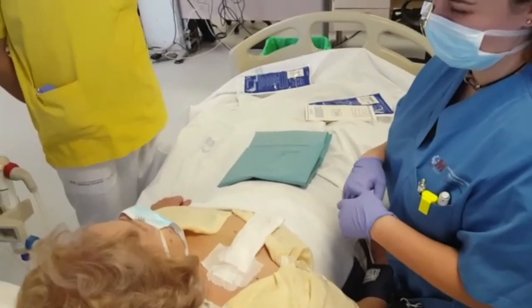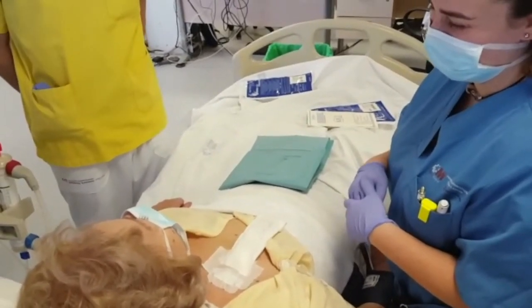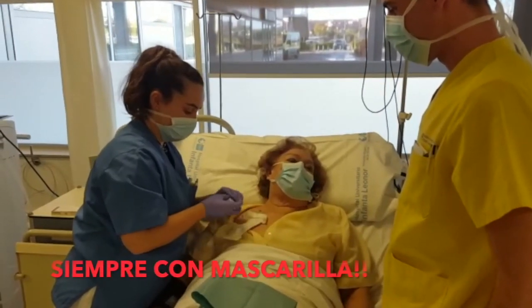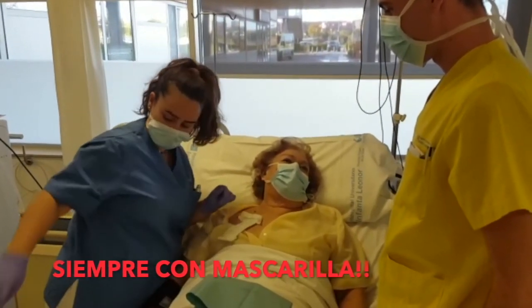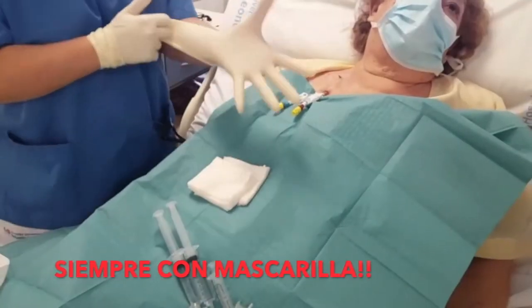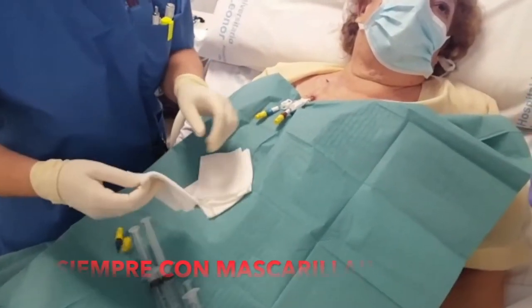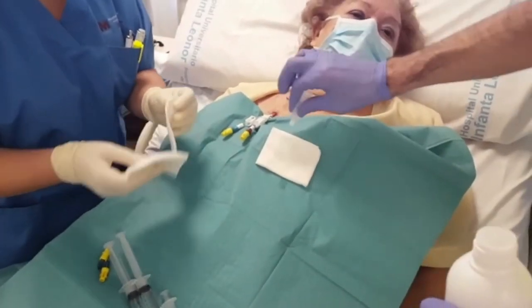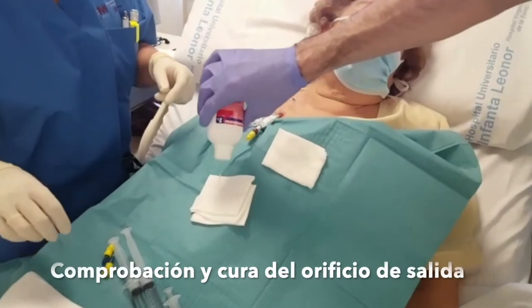Both the medical staff and the person carrying the catheter must wear a mask to prevent germs from infecting the catheter. Asepsis or hygiene measures are essential to avoid infections of the catheter. The nurse has removed the dressing and then put on sterile gloves.